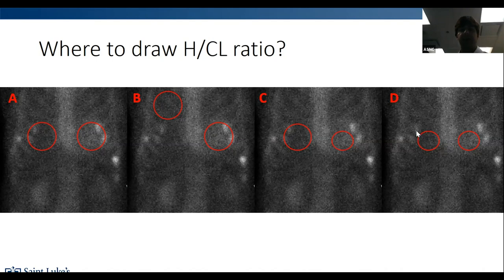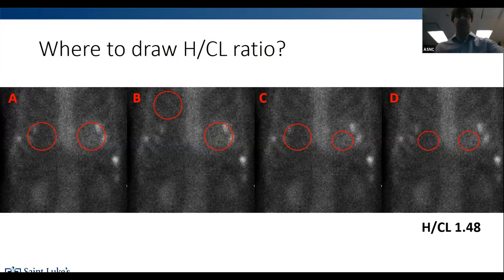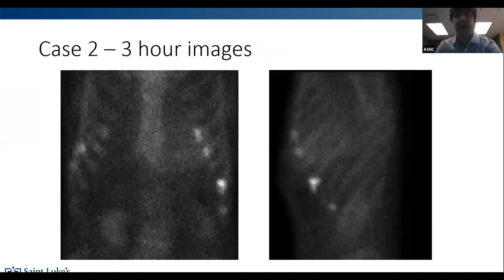Even for the contralateral lung circle, you have two hot spots right here. So you do want to avoid these. Sometimes people have a very prominent diaphragm that comes quite high, and if possible, you can avoid that. But this is how we say to grade these, obviously, too. And then the other thing is right ventricle. If you see a huge right ventricle that comes out on the right side of the chest, that may have some cardiac or blood pool count, so you want to try to stay away from that if you can. This ratio was 1.48 when we did it on the right.